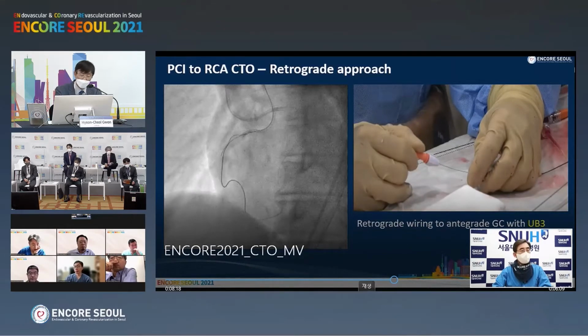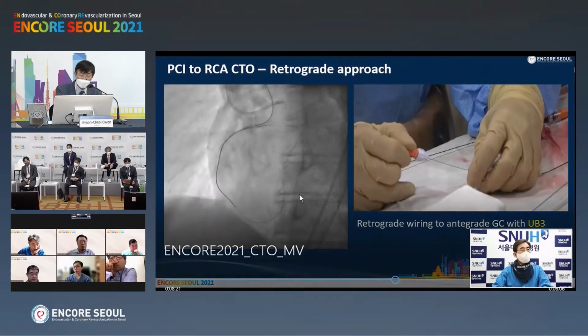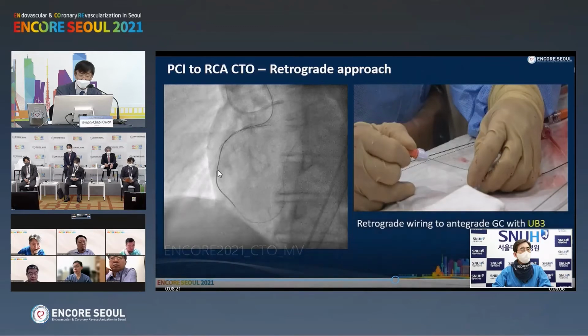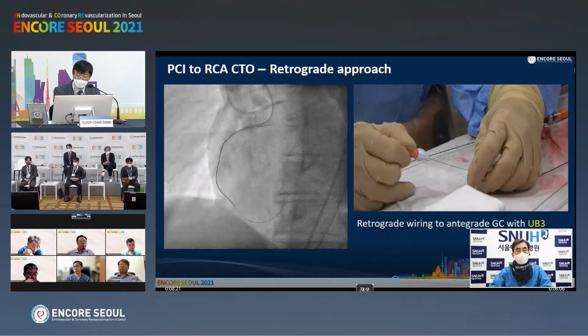Not so difficult to tell. Can you tell me the length of the total occlusion, based on the angiography, or would CT be better? Probably from here to the ostium, about more than 30 millimeters. So still in the plaque, not in the true lumen, right? Right, plaque is plaque, not the lumen. Within the media, within the vessel. Okay.